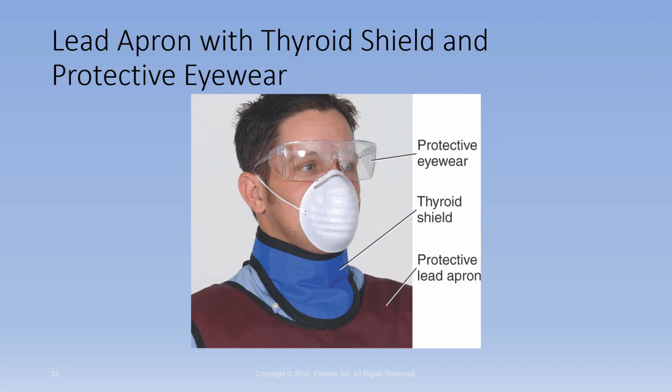Don't forget, we also have our cardinal rules of radiation protection, which are time, distance, and shielding. Okay, so time, reducing the amount of time that the fluoroscopy tube is energized would be important. Sometimes they'll make it a pulsed image, so that it's not always on. It just kind of pulses on, off, on, off, on, off.